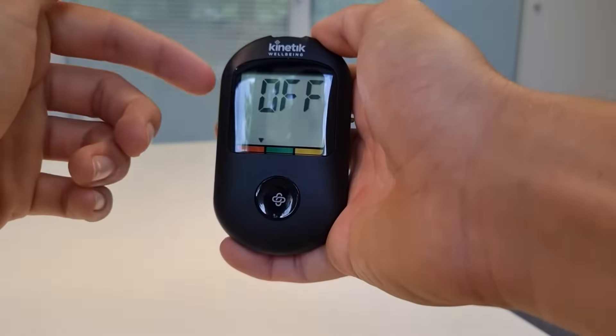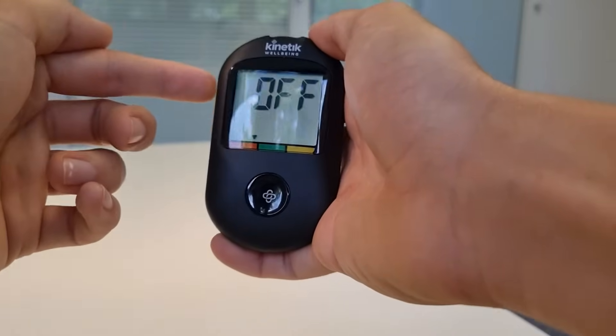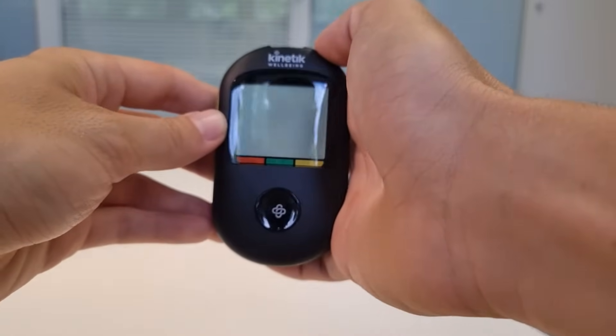You'll then get the option to set alarms if you'd like to — you can either switch one on or off. Once you've done this your meter is ready to go and you can begin glucose testing.